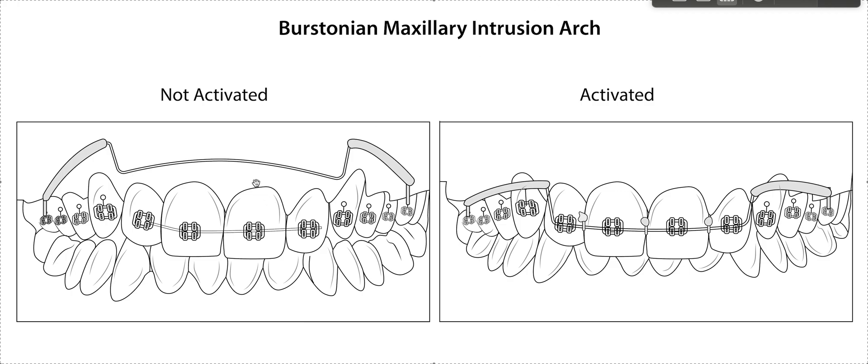Basically, this is unactivated and this is activated. You can buy these — we used to bend them out of TMA wire ourselves, which was a big pain in the butt. But you can buy them pre-made in NITI. Maybe it was OrthoArts — you're going to have to Google 'NITI maxillary intrusion arch' and scroll through. I definitely found one; they had it in two sizes: a 16-22 and a 17-25 — I would take the 17-25. Basically, there's going to be a base wire, which is your regular NITI.